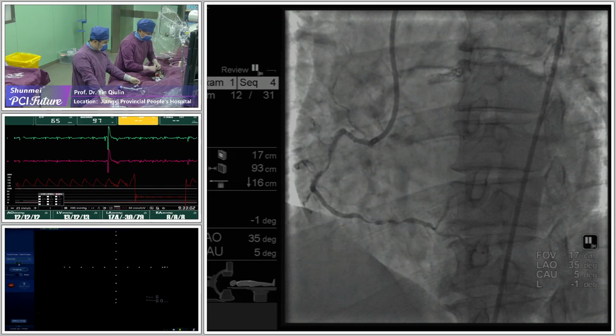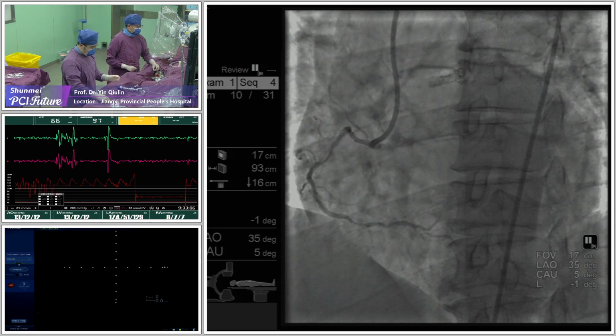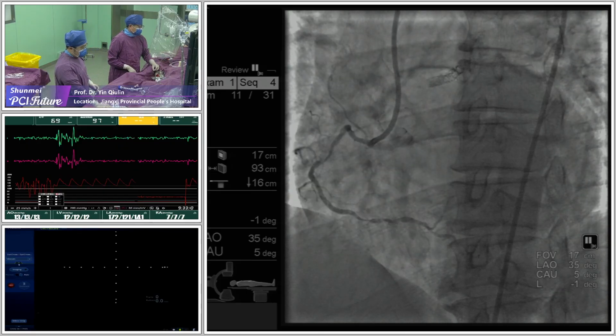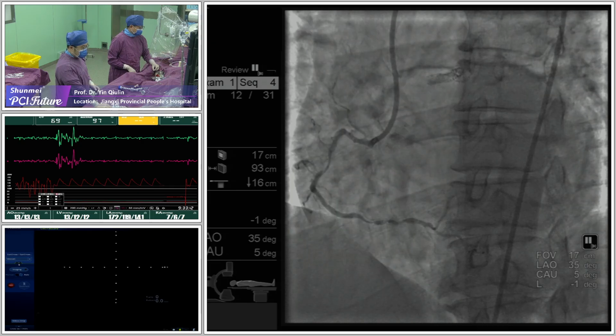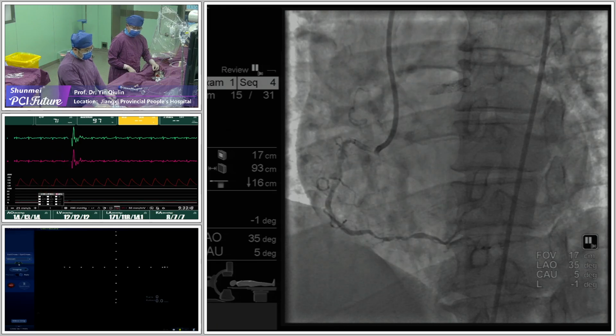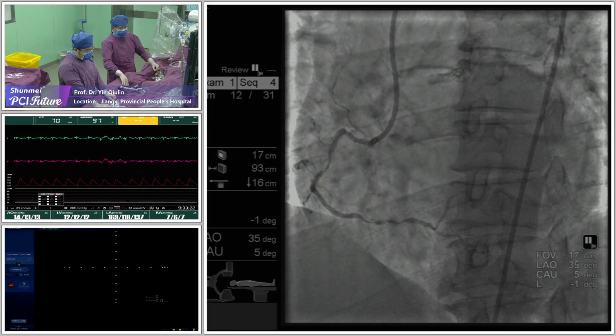For sure, in my opinion, the stent is not well apposed to the vessel wall, and there is some kind of gap between the vessel wall and the stent, and the wire is following that path through the subintimal space, and we have a problem engaging the coronary artery because of the ostial struts that are protruding into the aorta.